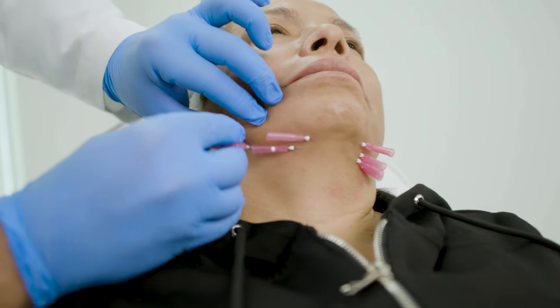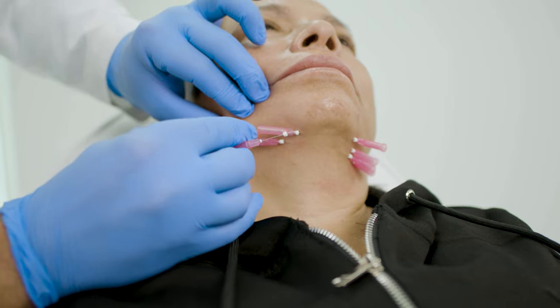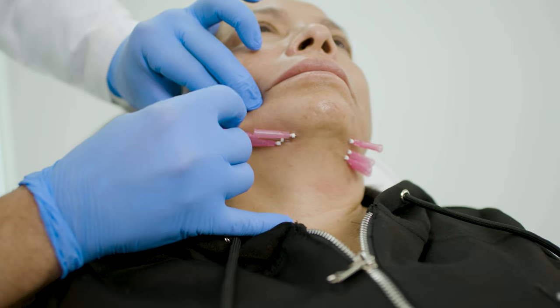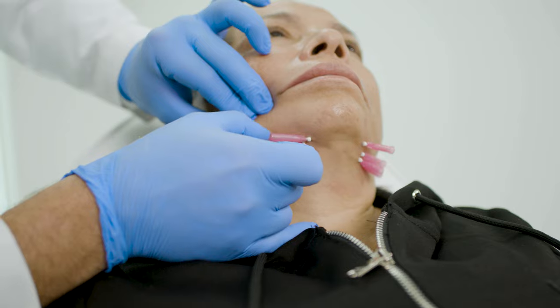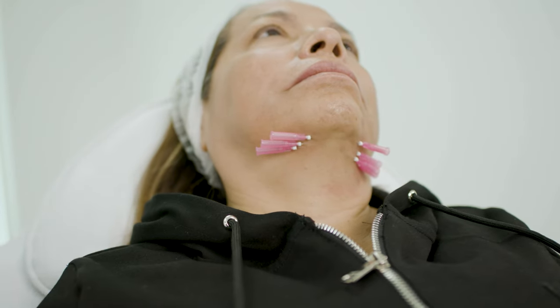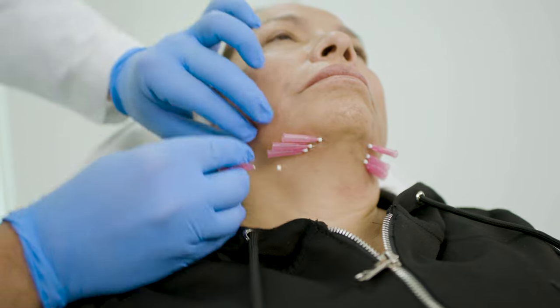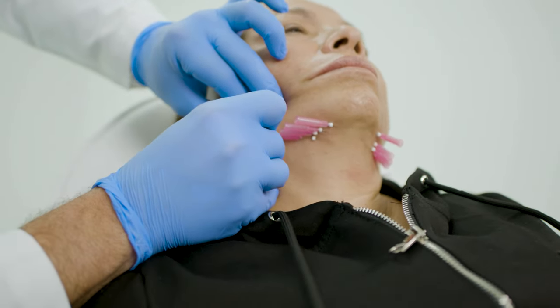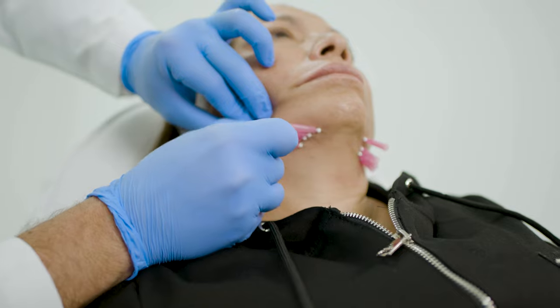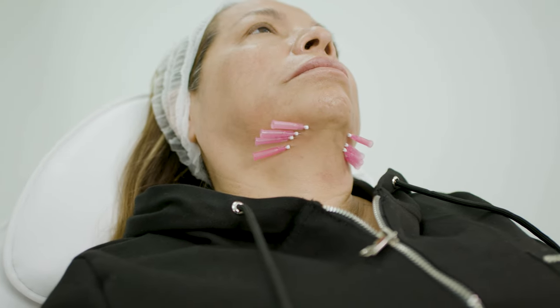You can see it's a pretty quick procedure with high patient satisfaction. Anything we do, we always want to think about how long the procedure takes, how much money we're making for that period of time for our practice, and what the patient satisfaction is. Because if you have a procedure with low patient satisfaction, you're clearly not going to continue to build your practice — so that's important to consider.